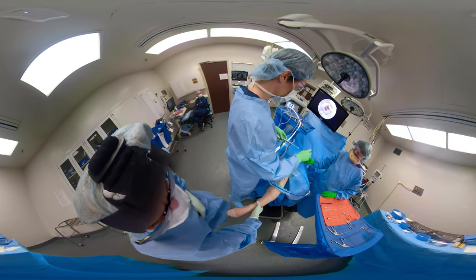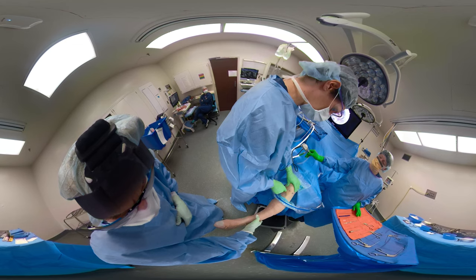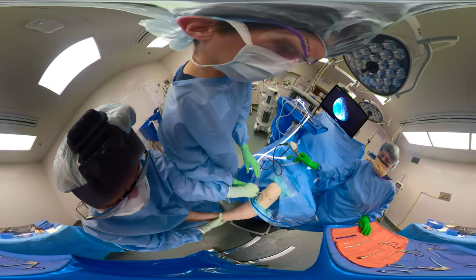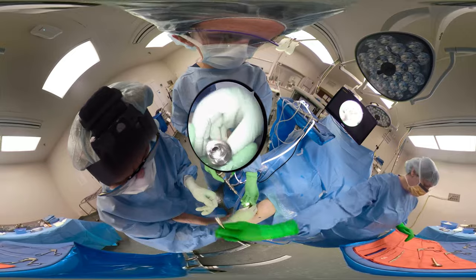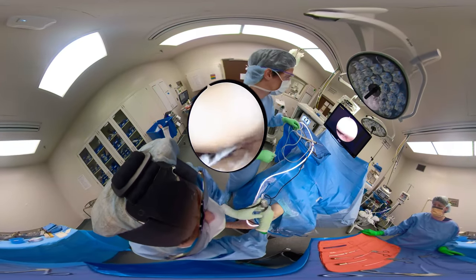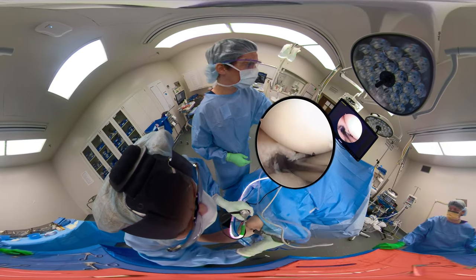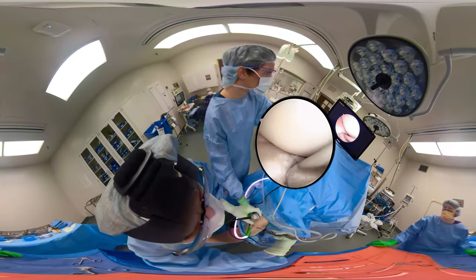Now we're going to put the scope back in the joint through the medial portal. We'll use our cannula and blunt obturator — not just push the scope in directly because we can ding the tip of the scope. Gently push the obturator through and put the scope in medial. This will give us a different access view of the medial meniscus. Then we'll put the shaver in the lateral portal, and you can see where we can easily access that mid-anterior third of the meniscus where we need to complete the meniscectomy on the tibial side.